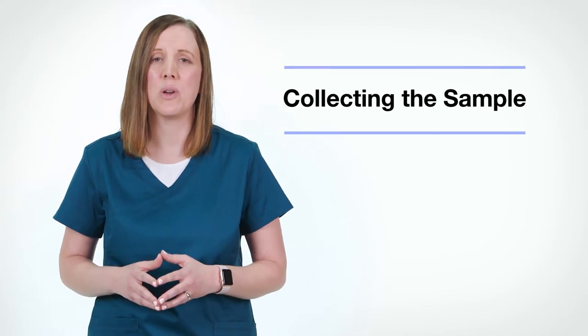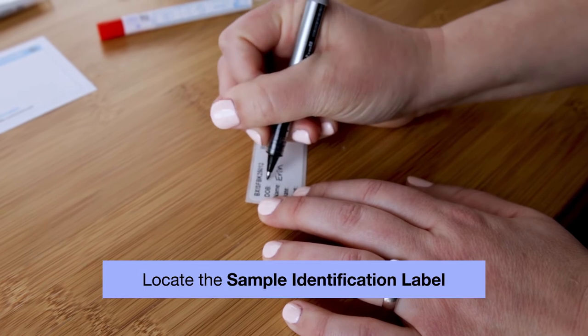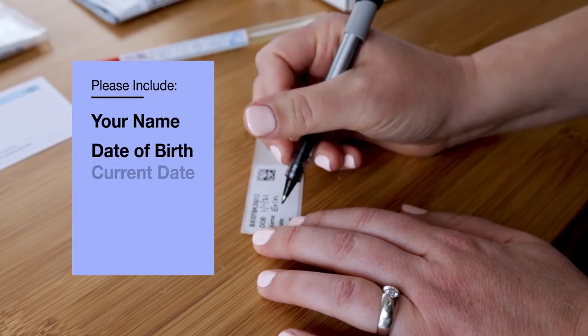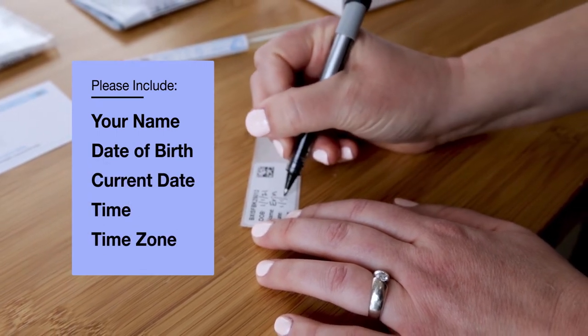Now let's start the collection process for your sample. Please locate your sample identification label. You will now need to fill out the rest of the label in pen by including your name, date of birth, as well as the current date, time, and time zone in which you collect your sample.